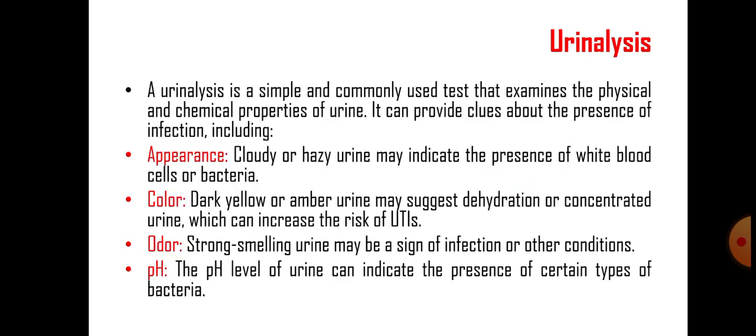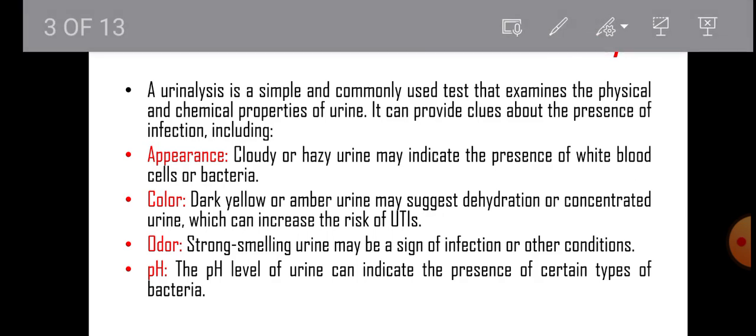What is actually urine analysis? Urine analysis is a simple and commonly used test that examines the physical and the chemical properties of the urine. One is the physical property as well as the chemical property of the urine, like the appearance of the urine. Cloudy or hazy urine may indicate the presence of white blood cells or bacteria.